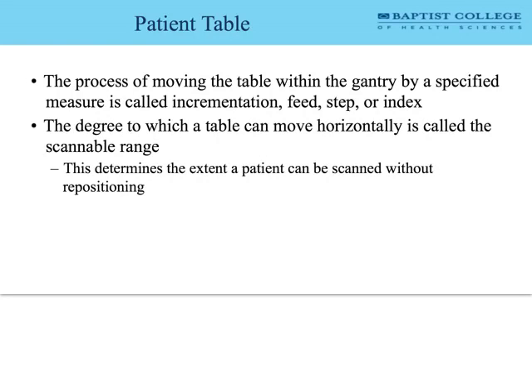So the process of moving the table within the gantry we will call feed or step or index. And the more intimate you are understanding the numbers and stuff that are happening on the gantry as you move the table around, the better CT technologist you're going to be. Because you will have a more intimate understanding of how you're orienting yourself within this pile of data, right?